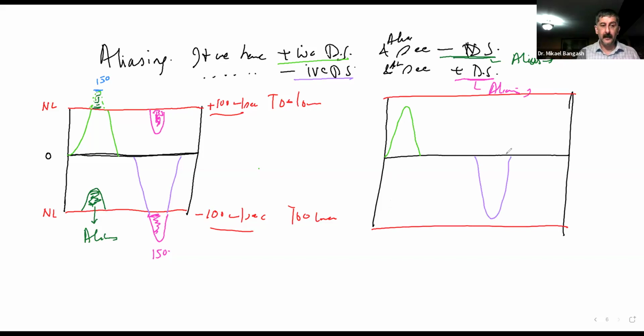But what we still may see, and guys, this is pretty normal, there's nothing wrong in that, it's a natural finding, is a slight negative Doppler shift like this, but you're positive, and you may see a slight positive Doppler shift like this with the negative.